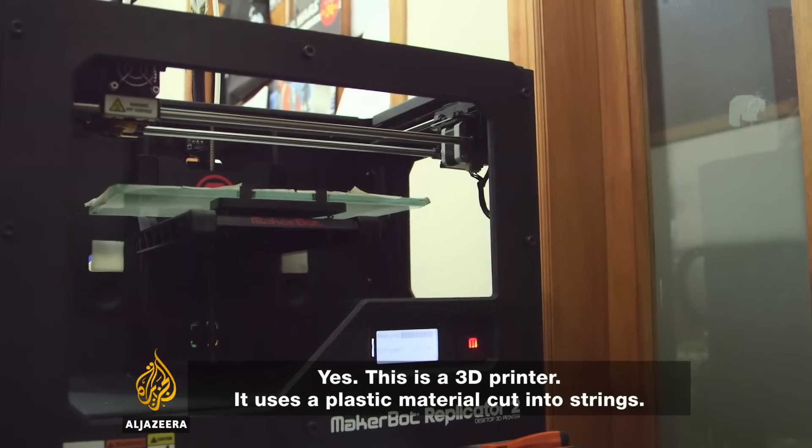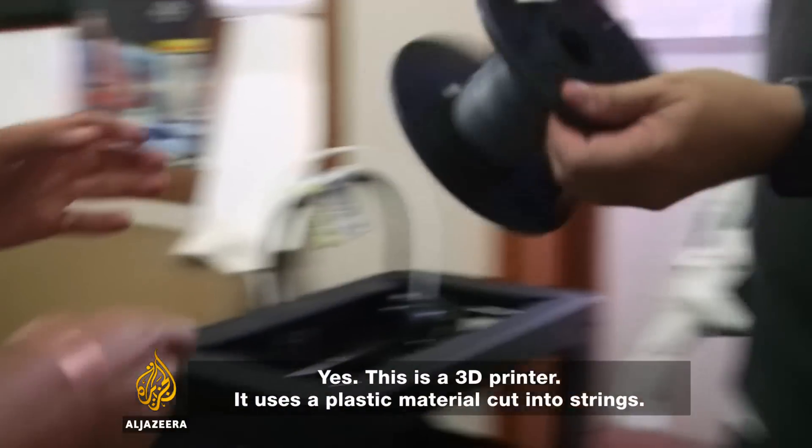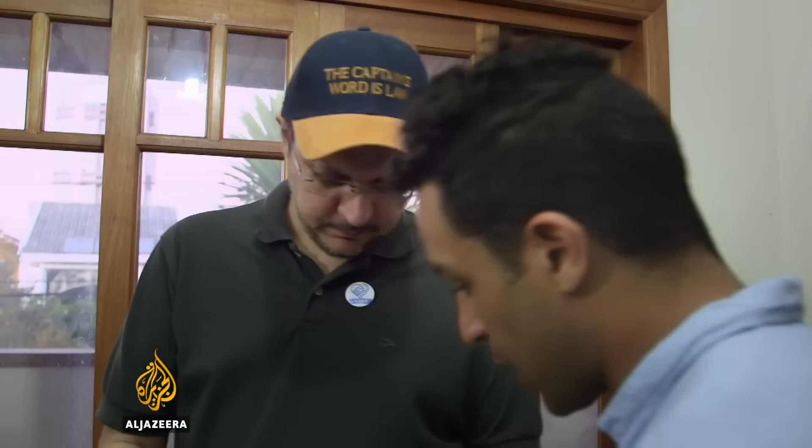And this is a 3D printer. It uses plastic in a wire format.